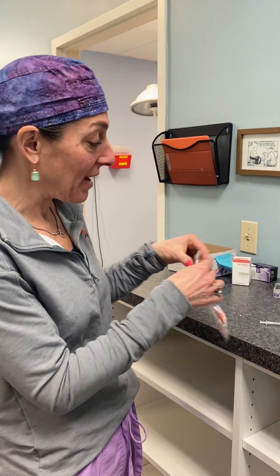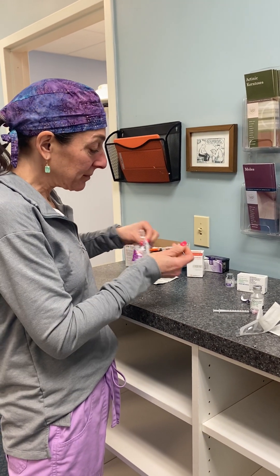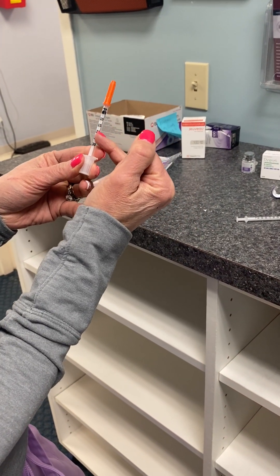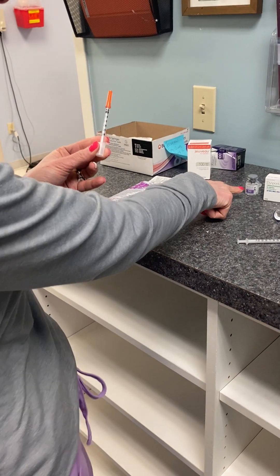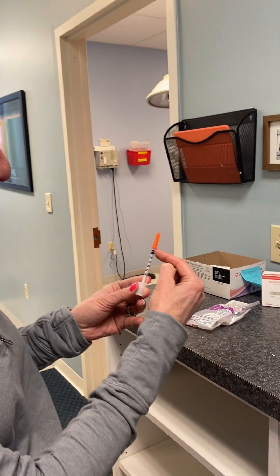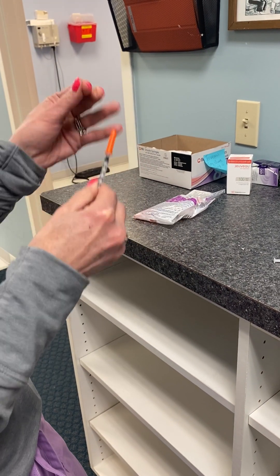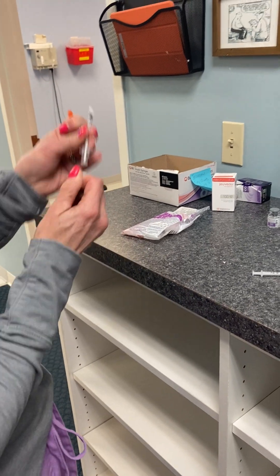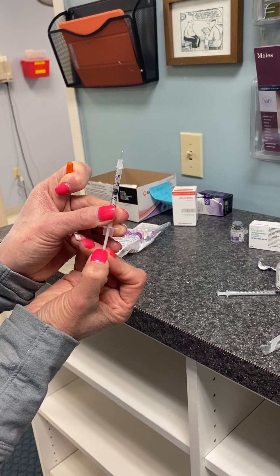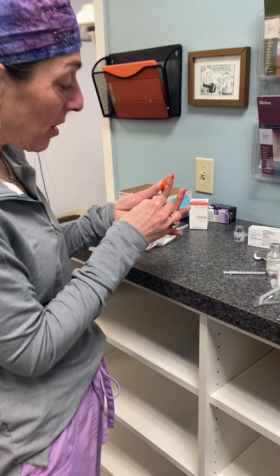These are pre-measured insulin syringes. When you draw up Botox, one unit of Botox equals one unit on the syringe. So five units is here, ten units is there, fifteen units, twenty units, and so on.